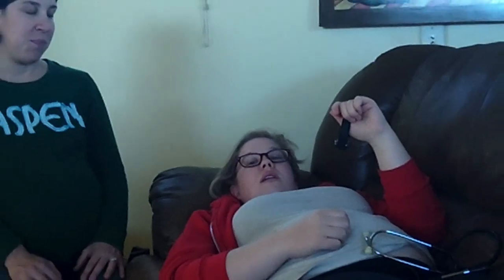Anything else we're forgetting? If you were to find it, what kind of sound would you be listening for if you've never heard it before? Like I said earlier, the earlier you are, the more slight the sound is. So it can almost be like a faint little tapping. And I think the best way, especially when you're new to listening and haven't heard the sound before, to feel confident that that is what you're hearing is probably to count.